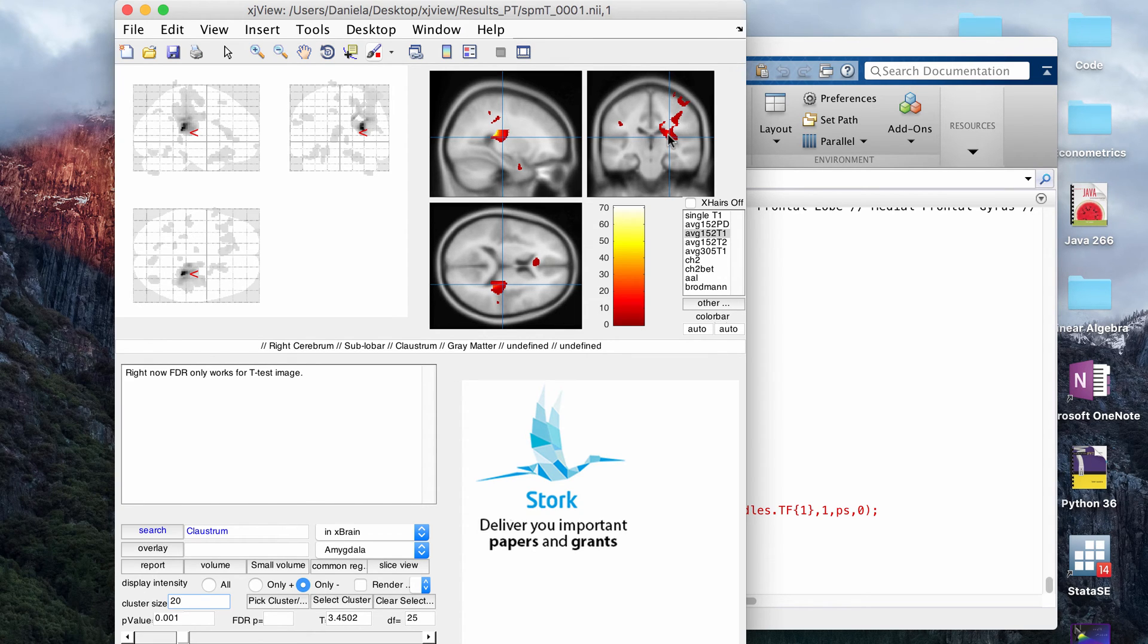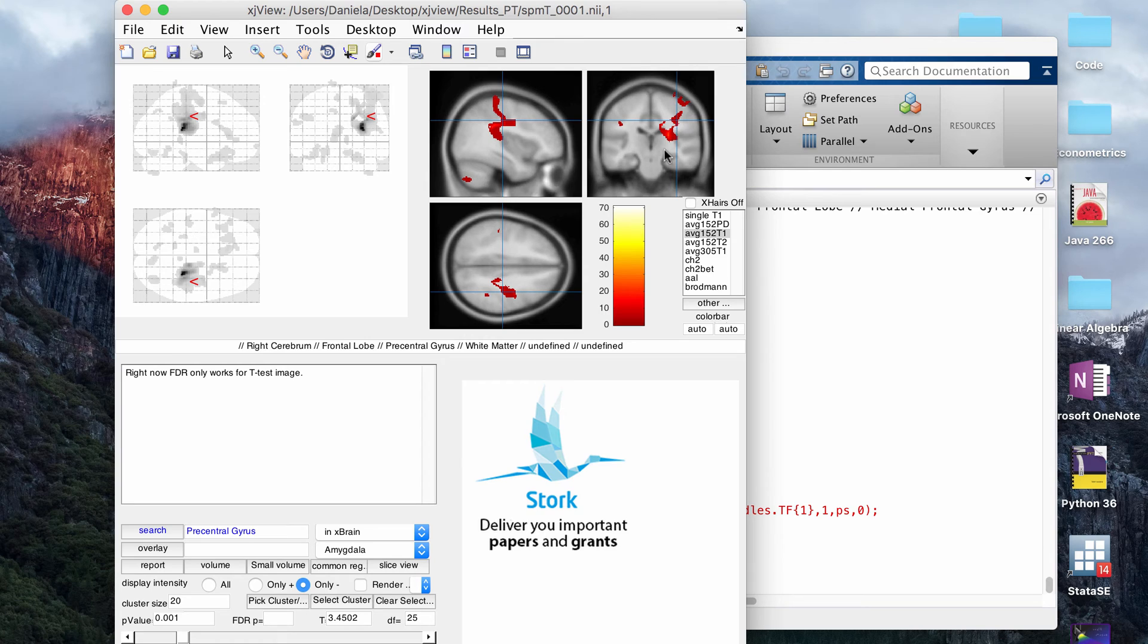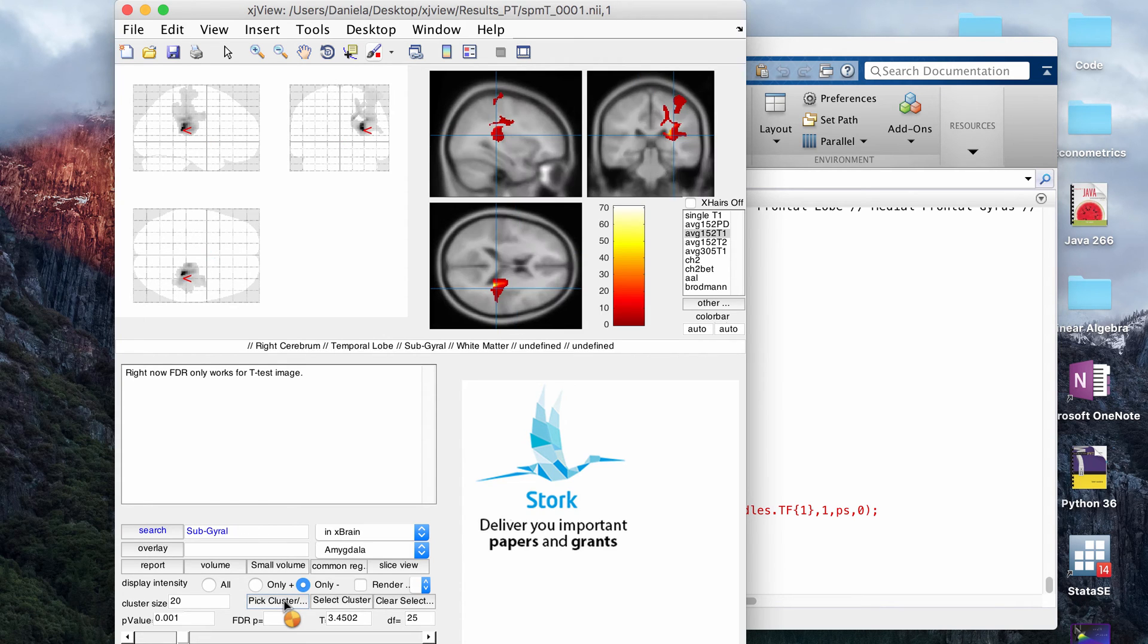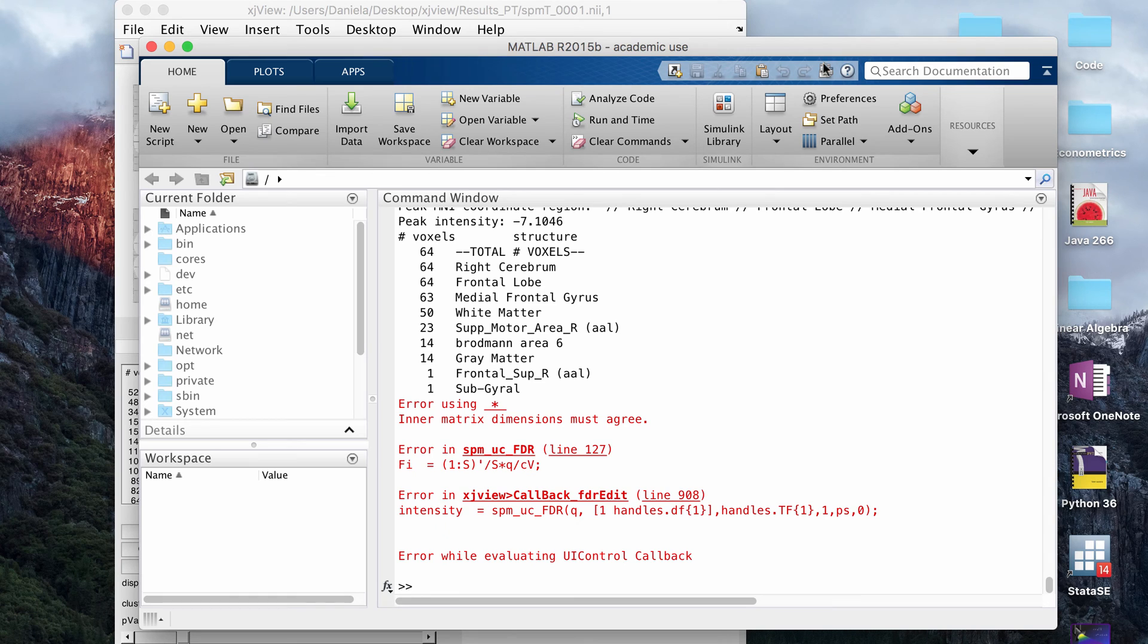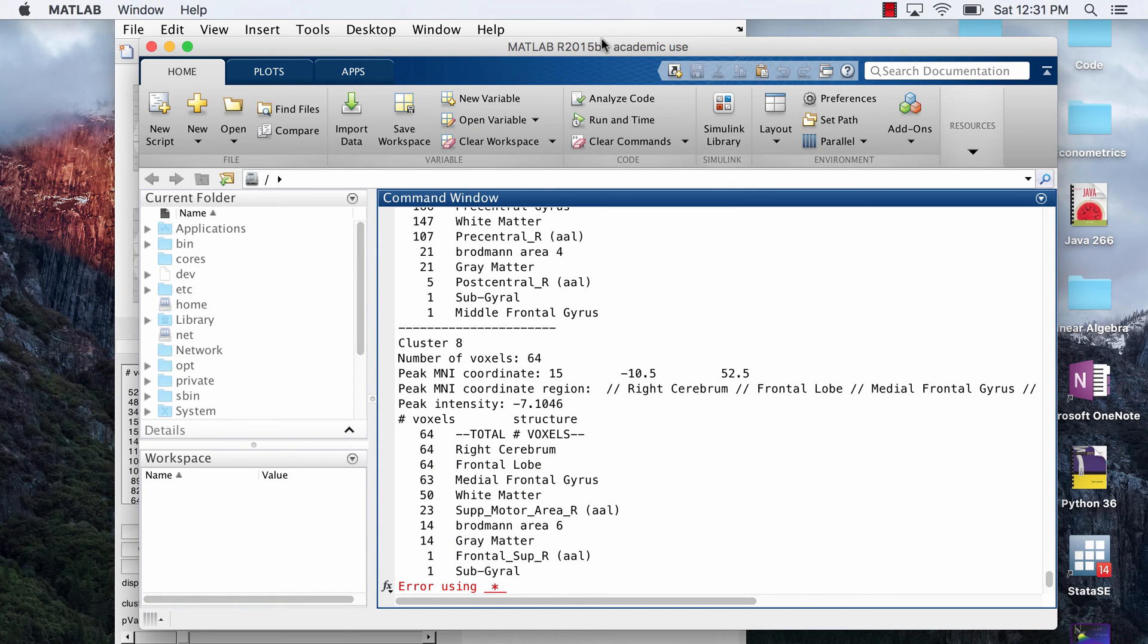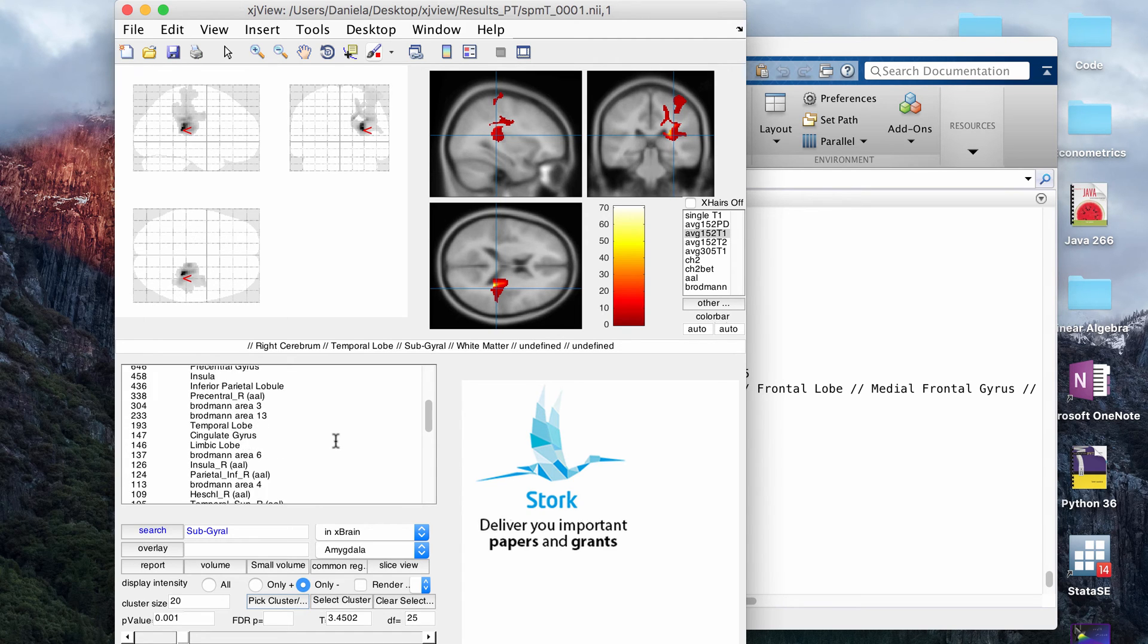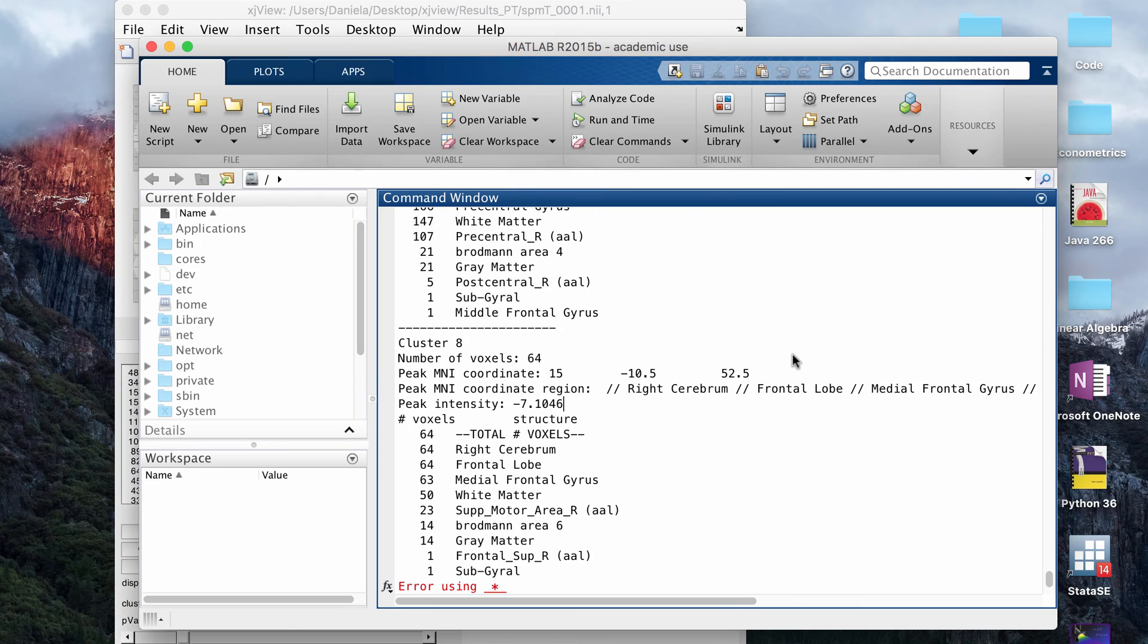Another thing that you sometimes will use is that you're looking at it and you're wondering, well it says that there were maybe eight clusters, and you're wondering what is considered a cluster. If you click, for example, one part that you think is part of a cluster, such as here, you can click this window or this button here that says pick cluster, and it will show you that one cluster. Even if here it looks like it's separated, this whole thing is being considered one cluster when it's calculating the number of voxels and the statistics, for example. If you click that here, it will also print out a report in this window and tell you, okay, this cluster has a lot of voxels, over 5,000, and then it'll give you all the same information from the report, but just for that one cluster.